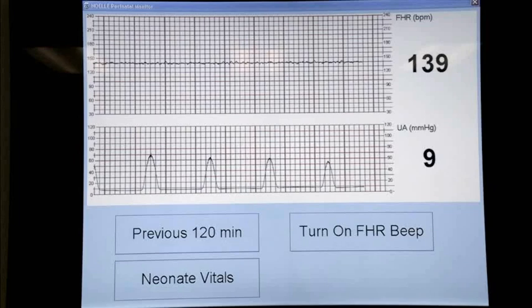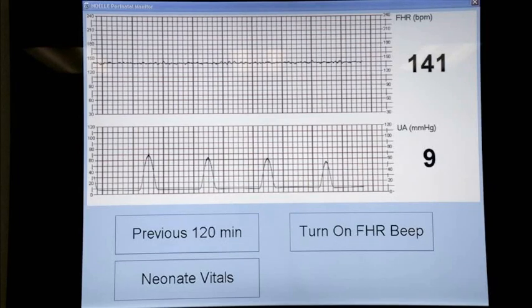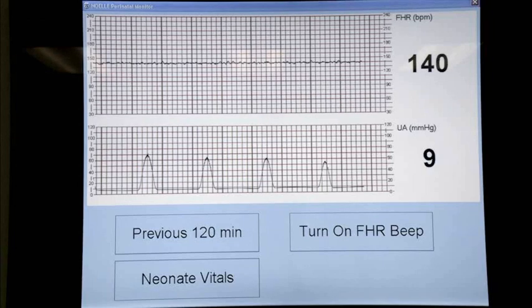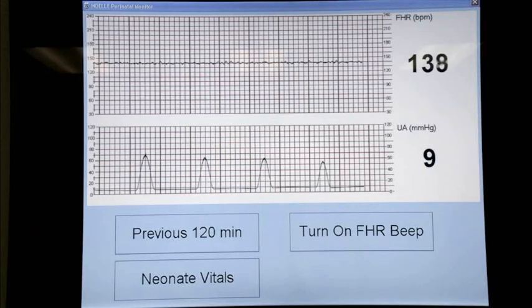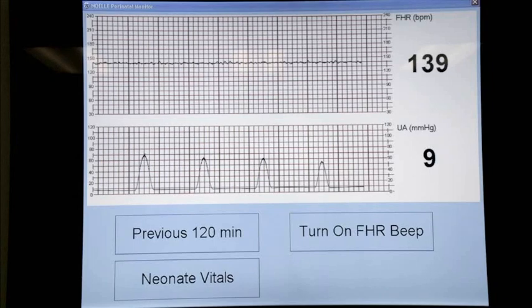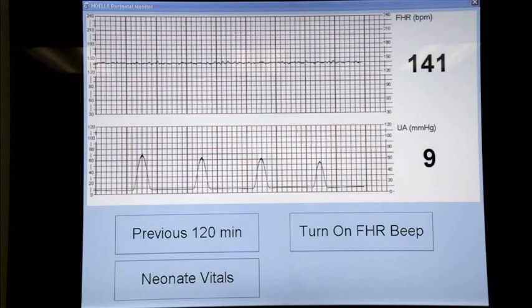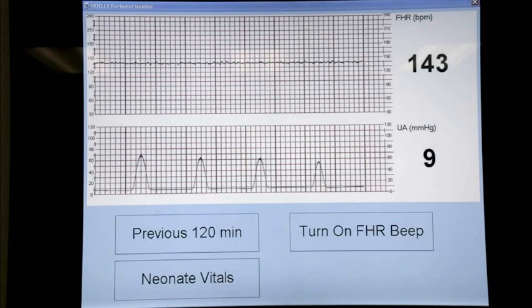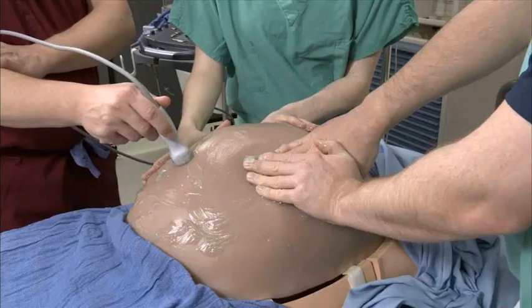Measure fetal heart rate at least every 2 minutes, preferably by ultrasonography. A third person can operate the ultrasound probe during version itself. If the fetal heart rate is reassuring or quickly returns to normal after brief decelerations, up to 4 attempts at version can be tried. If the fetal heart rate stays low, do an emergency cesarean delivery.